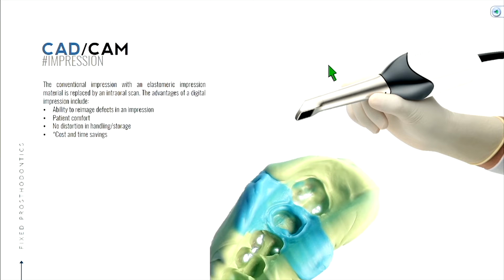Okay? So it's maybe savings that you see down the road. So one other thought about this impression, the principles of good impression making, whether it's digital or analog, are still the same. So you still need a nice clean margin.